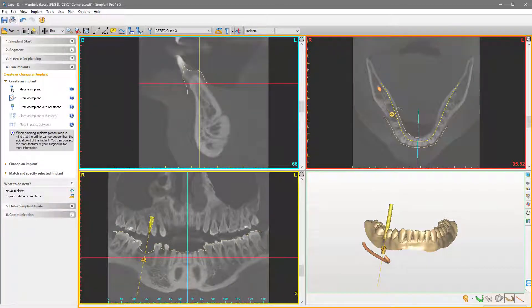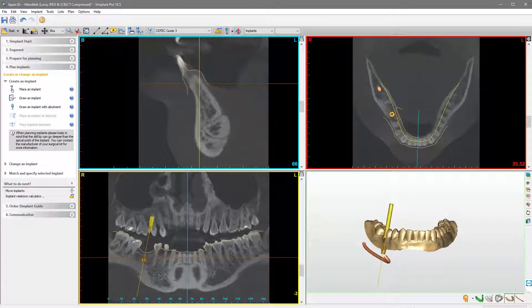Additionally, there are four windows: three 2D views and one 3D view. The 2D views are framed with different colors — red for the axial view, blue for the cross-sectional view, and yellow for the panoramic view.